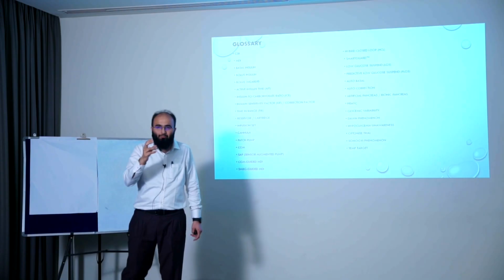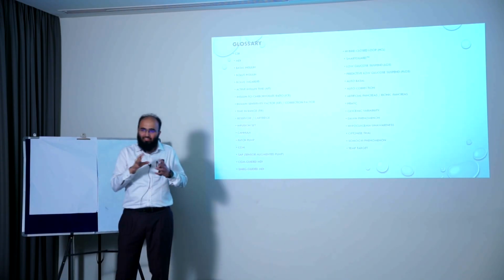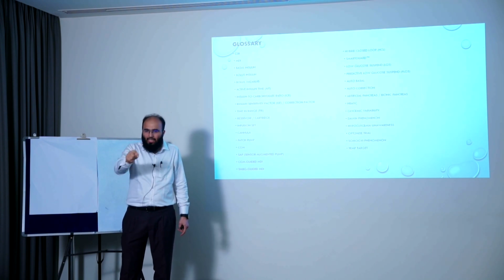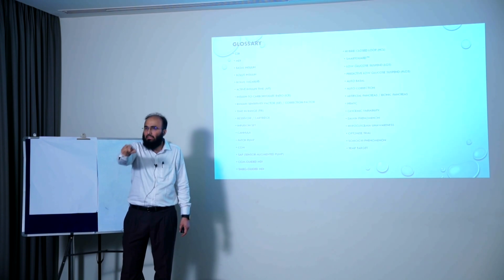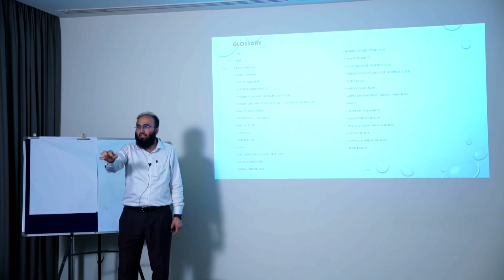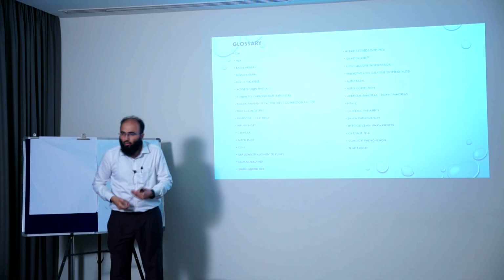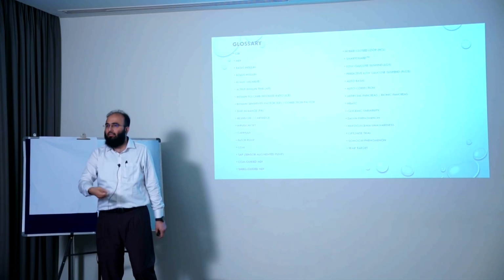So similarly, now the pump knows that if this patient's sugar is dropping by 2 mg per deciliter per minute and his sugar is say 100 mg per deciliter now, in the next 15 minutes, this patient will hit 70. So it will suspend the delivery of that rapid acting insulin that it is delivering.